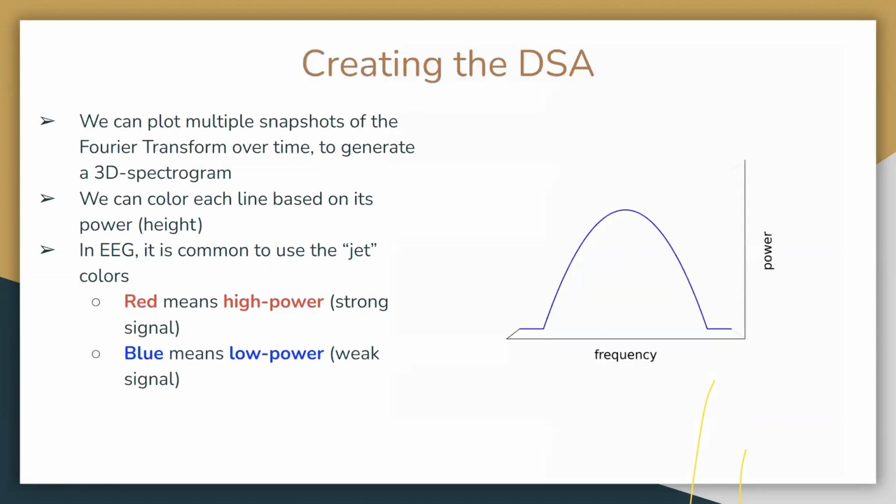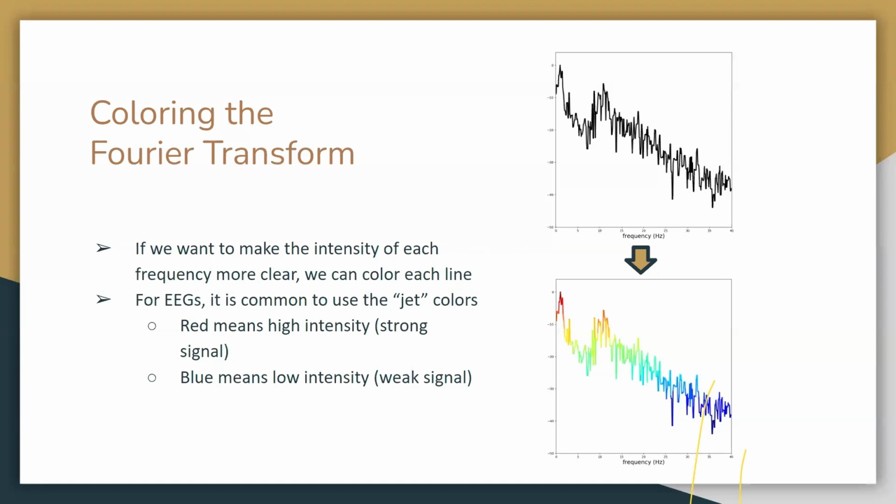So your scale on the left is in decibels, or? I've scaled this in decibels, which is a little different than a linear scale. It's a logarithmic scale, but it's a useful value. Pretty much anyone who measures sound or any signals after the Fourier transform likes to work in decibels. It makes the math a little easier to do once you've done the conversion.